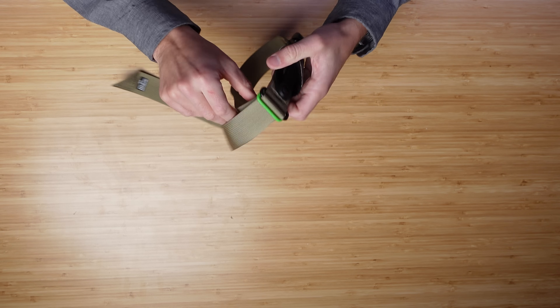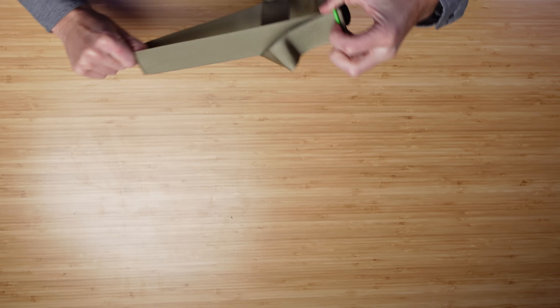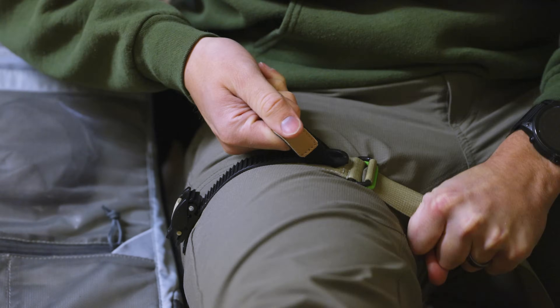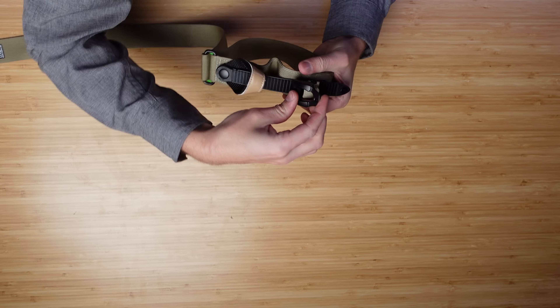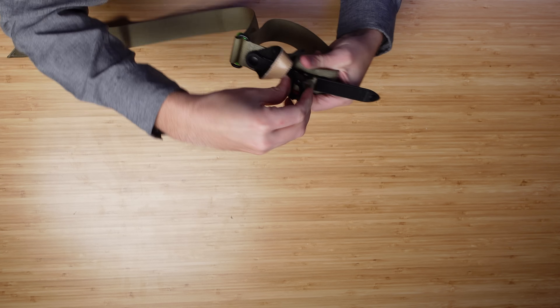To put this on, you just have it sized however you need it. You can do self-application, but it is relatively hard to do, and we'll talk about that. You throw it on any extremity, tighten it down as absolutely tight as you can, and then once it's tight on the limb, you use this buckle and ratchet it in, and it's going to compress very, very nicely.